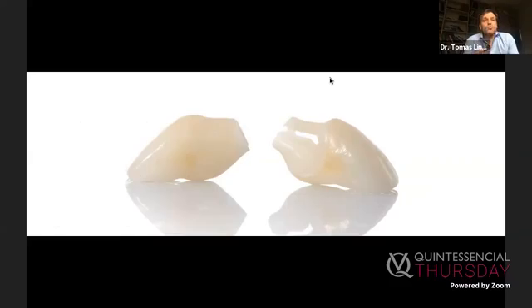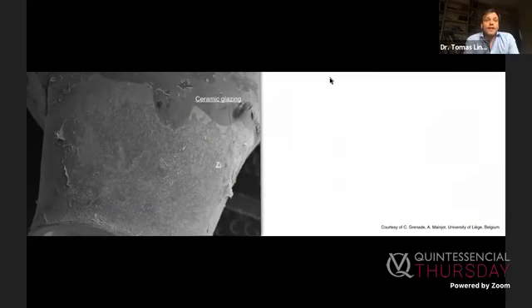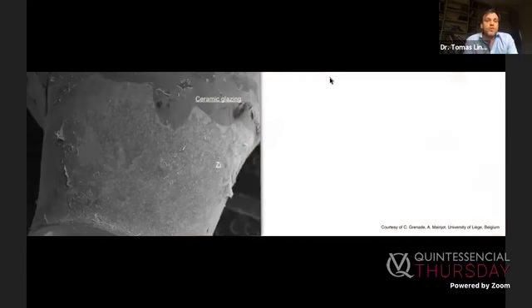That's why we really tend to super polish the subgingival part of our zirconia, do not glaze it, do not cover it with ceramics, and that's the protocol which we are using. And some years ago I was really encouraged by a study from Liège, which Professor Rompen shared with me. They looked at what kind of cells they see around a removed restoration. When you remove a restoration from the tissues, there's sometimes adherence of the cells. They wanted to see what kind of cells.